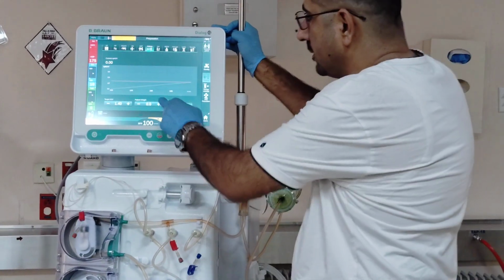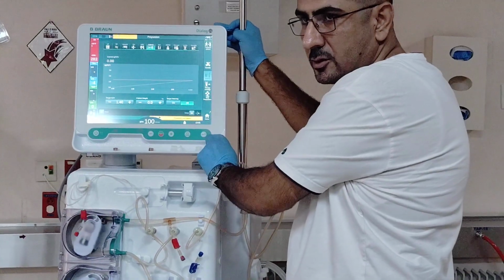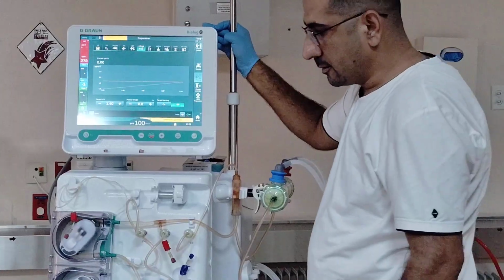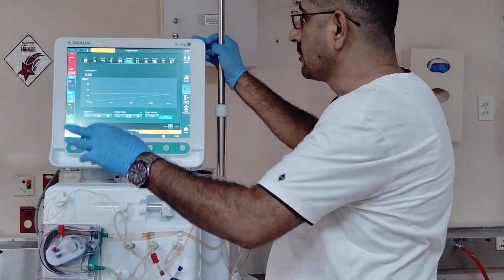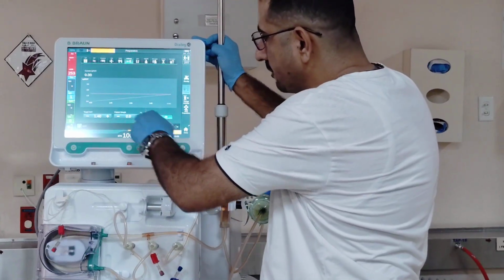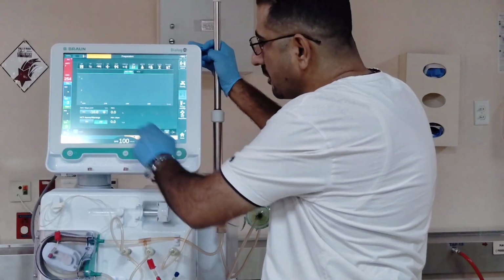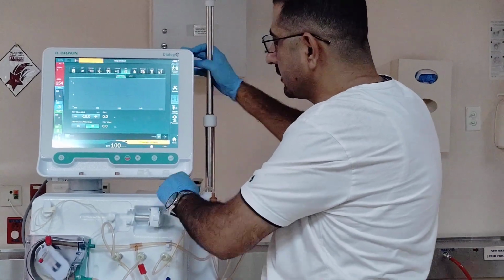By the way, the system now is ready to connect our patient. Okay. This is the target of the patient weight. In terms of the hematocrit also, you will get a new curve for the hematocrit.